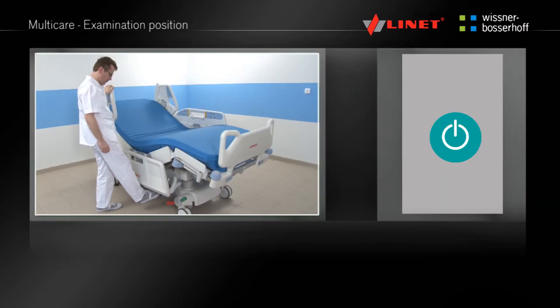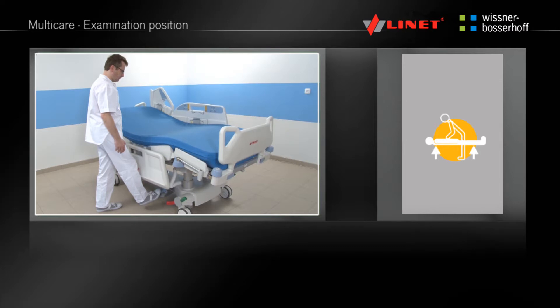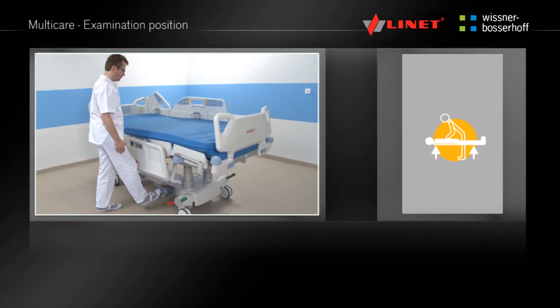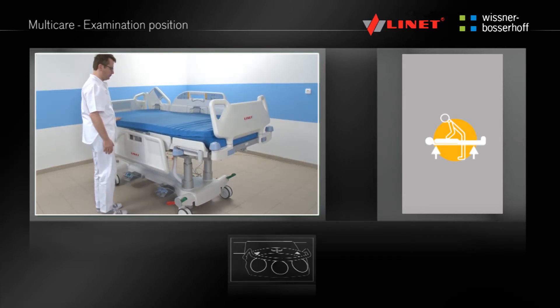Activate the function by pressing the Go button. Press and hold the pre-programmed function button until the examination position is reached. At the same time the bed is flattened and positioned to the optimum height for patient examination. This button can also be found on the foot controls.